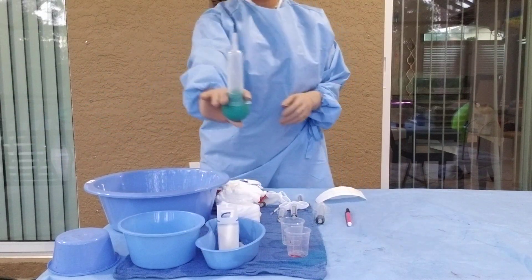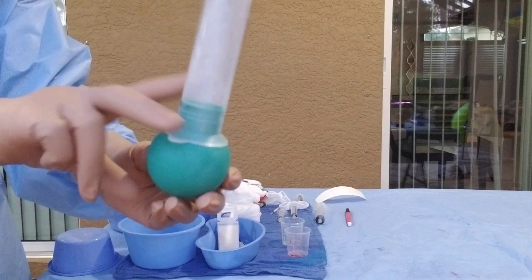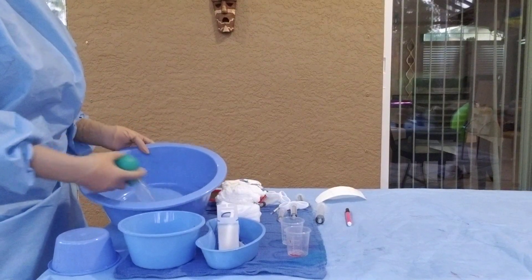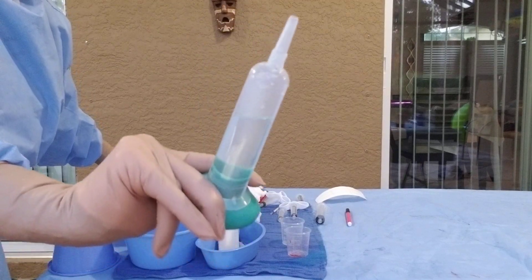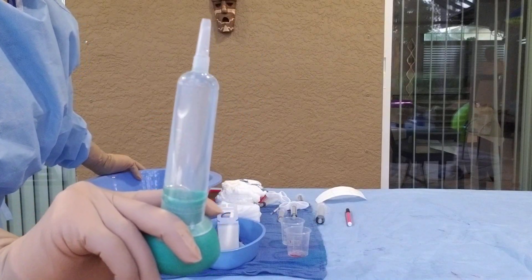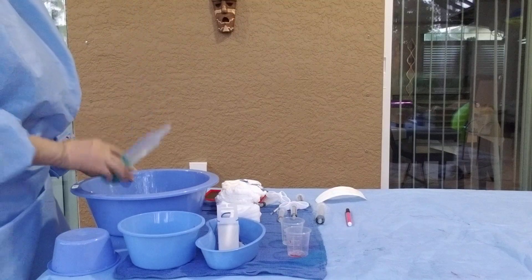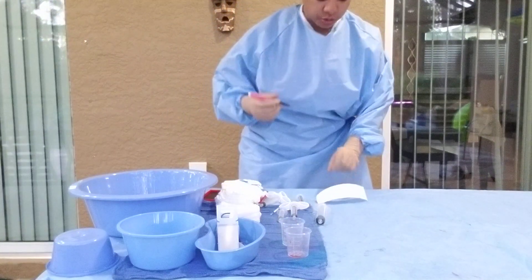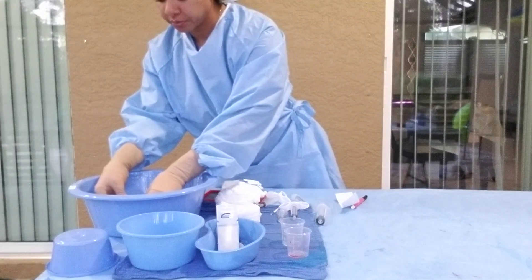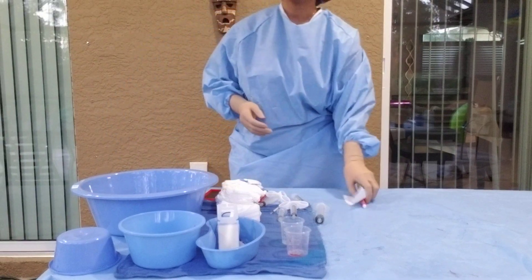Now we're going to prepare. We have our asepto — the squeezable bulb syringe. Most of them have two little finger grips. The best way is to hold it, squeeze, and let it fill up — repeat until it's fully filled with saline. Best practice is also to label your asepto, so now it's labeled with what's in it: normal saline / sodium chloride.